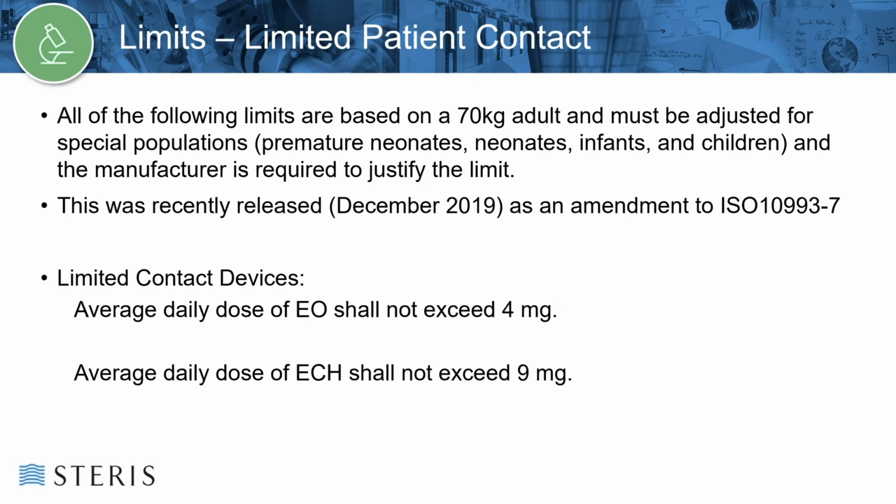Extraction temperatures of 37 C, body temperature, are used for devices that are wholly or partially in contact with the body during use. Room temperature, 25 C, is used to extract devices with no immediate patient contact during use. An example would be hypodermic needles. Headspace analysis is performed within a closed vial with air at 100 C.